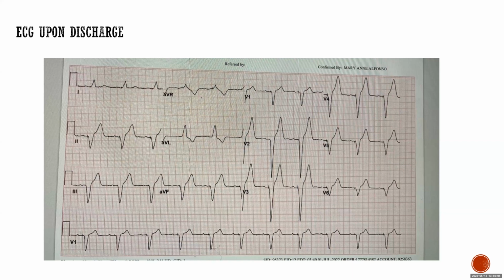Is that clear? Anyone has any question about this? So when you see ventricular pacing following P waves and the P to the spike is constant, you can conclude that the device must be seeing the atrial activity because it waits for a fixed period of time. This is the triggered activity we talked about. Good. If no questions about this ECG, I'll show you when this patient came for follow-up.